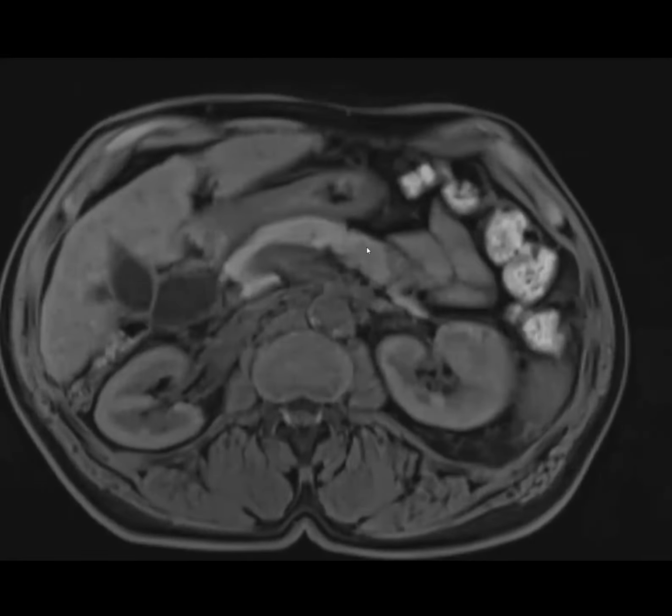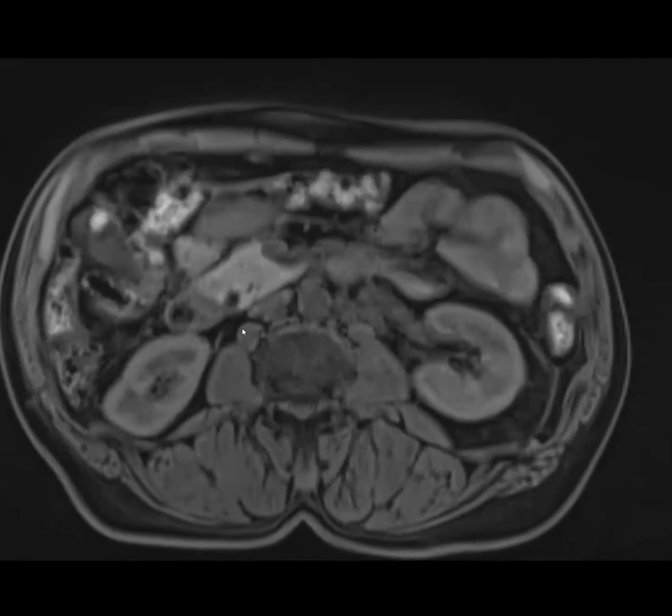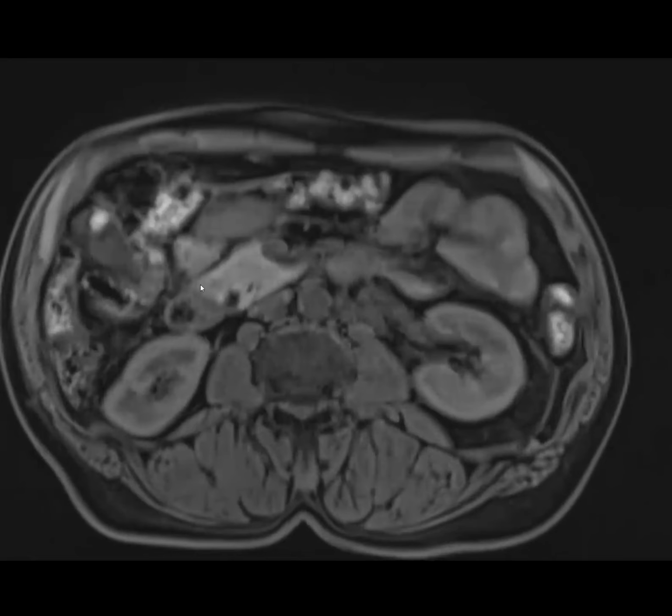And we can see the pink. Oh, I didn't know it had manganese. Yep. That's what causes it to be T1 bright. And you see, my tissue over there is bright, just like the pancreas, now unlike anything else here, right? So that definitely goes for ectopic pancreatic tissue.